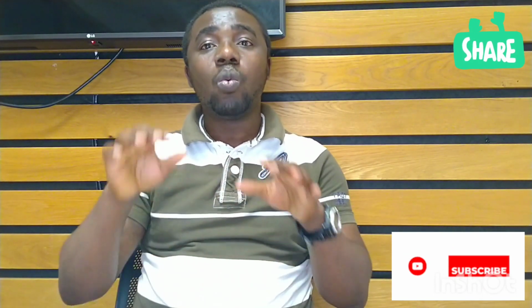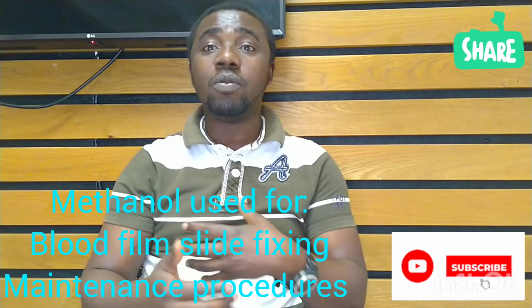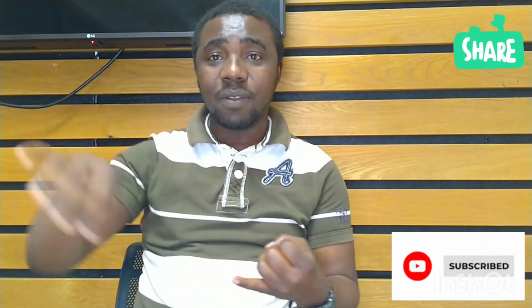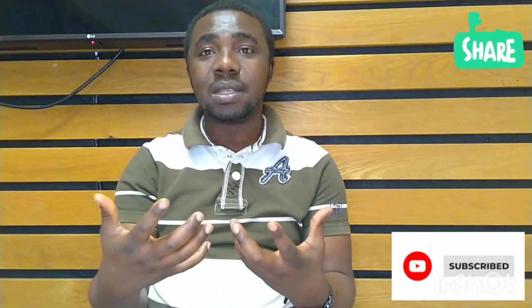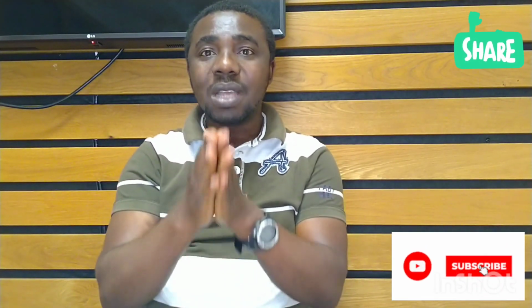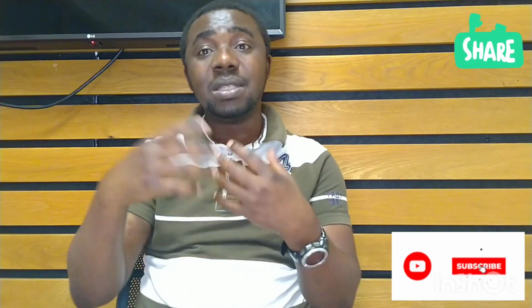And of course, another thing it uses is methanol. And what does methanol do? They use the methanol to fix, because after the film is made, you allow it to dry. Following the drying, then you fix it. So why are you fixing this slide? You are fixing it because you want everything that is on that very film to remain intact. That will then help once it's stained, you see.